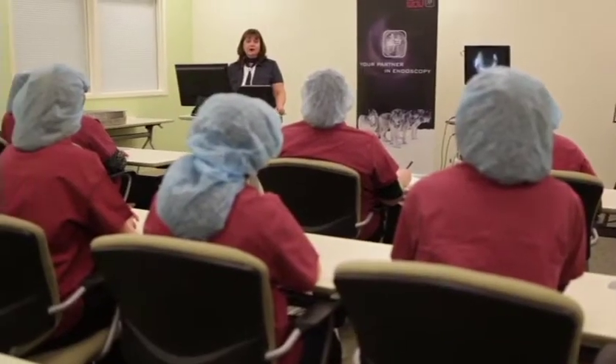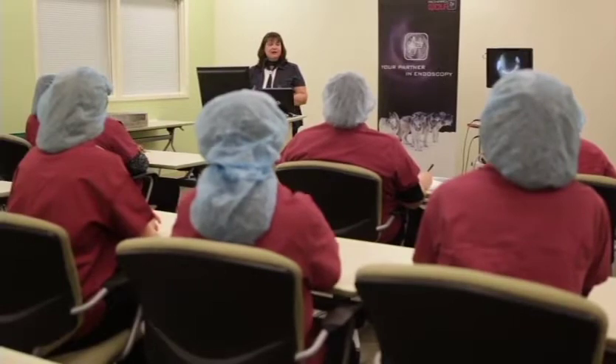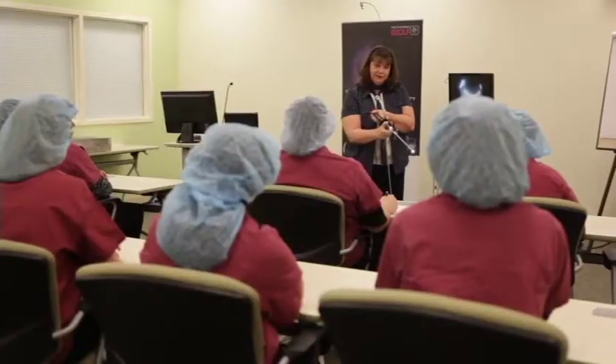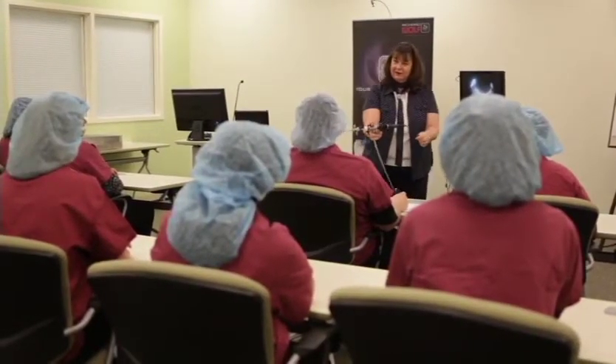The facility staff in the patient care areas and Central Sterile and Supply Department, or CSSD, require thorough education for the proper care and handling of flexible endoscopes.